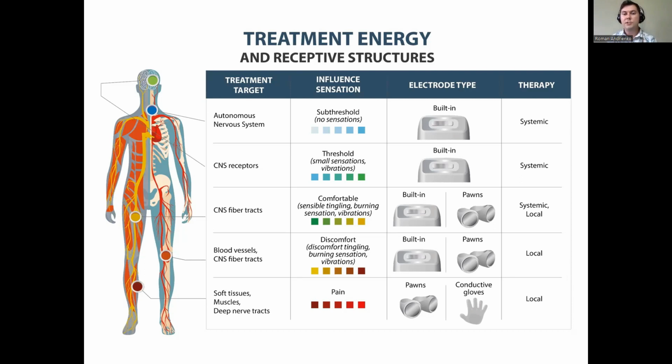So what am I doing? If we're dealing with acute trauma, something fresh, some pain with clear borders, obviously local, then we'll be operating with high treatment energy levels. And we will look at local therapy. You see that here, it has the word local.